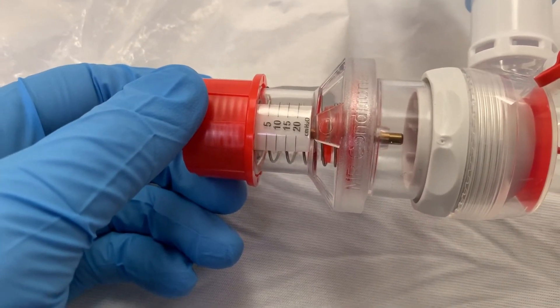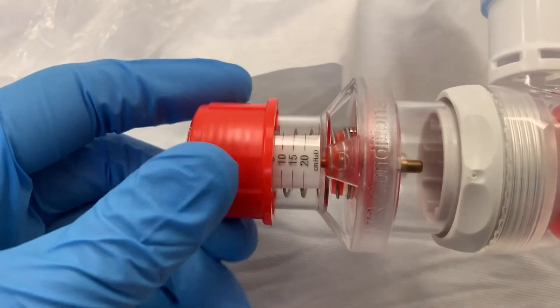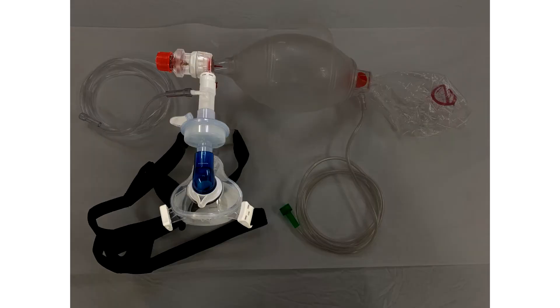Ideally, you want to titrate up your PEEP slowly up to 10. I wouldn't go much higher than 10 because most low esophageal sphincters open at around 20. When your patient is awake and spontaneously breathing, they can power that PEEP valve almost on their own. The exhalation should power it, but the inhalation won't have any PEEP.